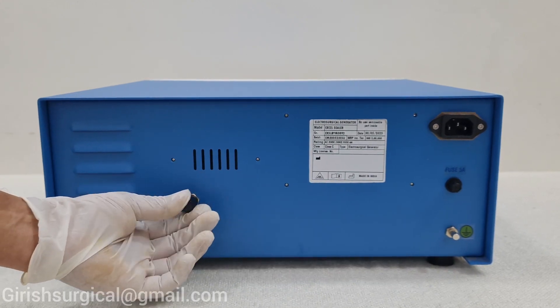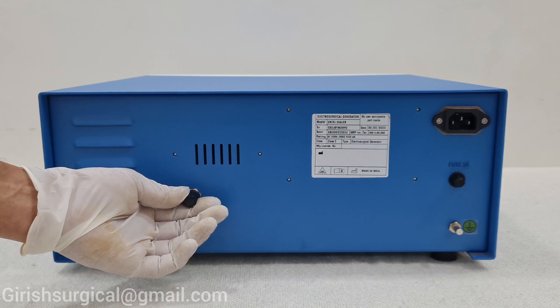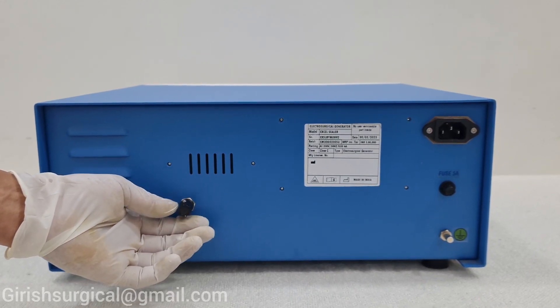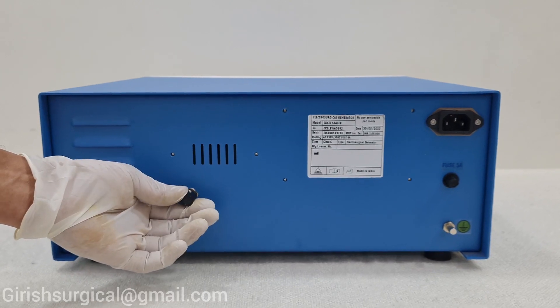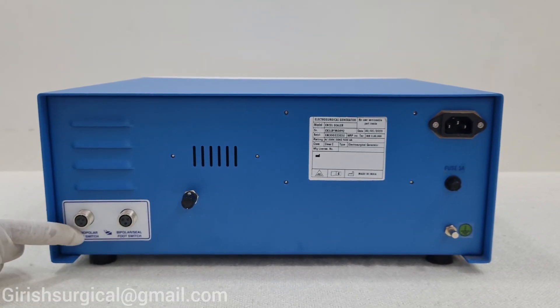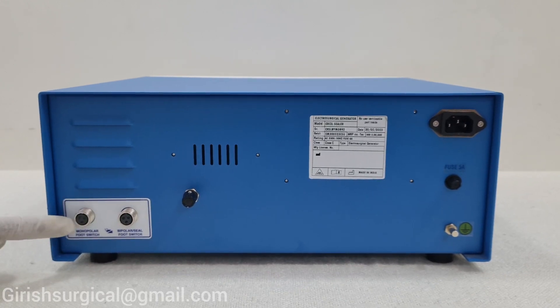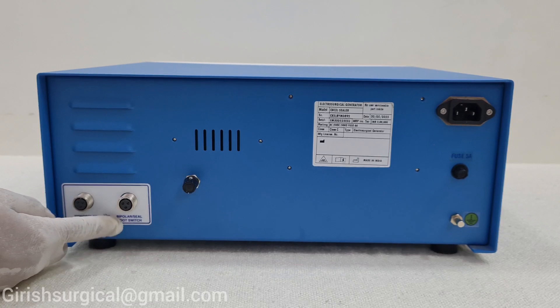Here is the volume knob. When you use the machine, the volume comes when you press the foot switch or the hand switch pencil — it indicates that the machine is working. With the volume knob you can control it. Here you can insert the monopolar foot switch, and this is for the seal foot switch.